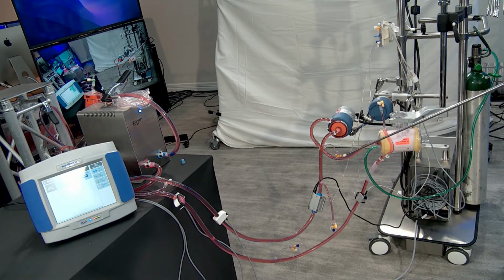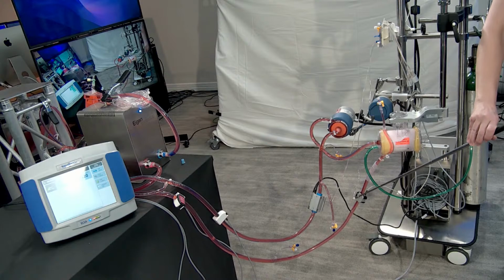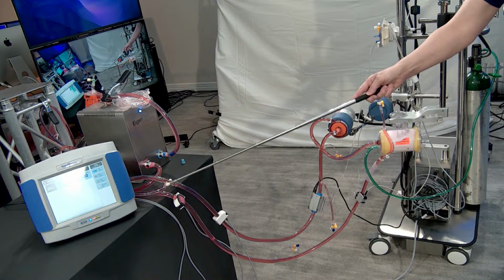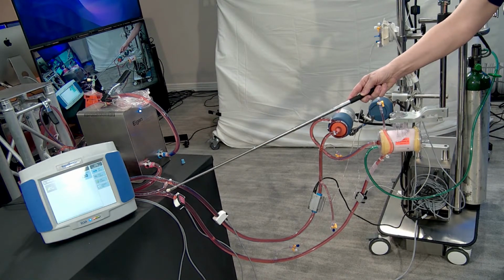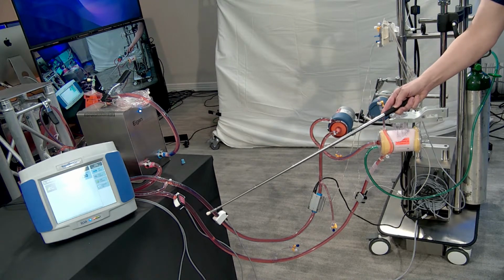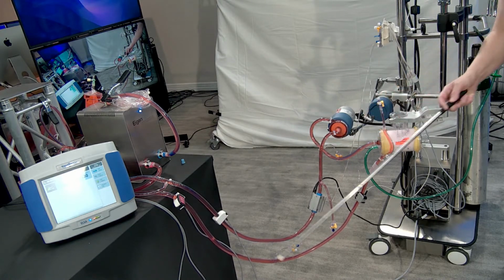Through the pump, it goes into this oxygenator, where the gas goes in, hooked up to an O2 tank. We've got our flow meter here, and then we come back out of the circuit and go back into the patient. If this were VV, this would be your access and this would be your return. If we were VA, this would be your venous and this would be your arterial.